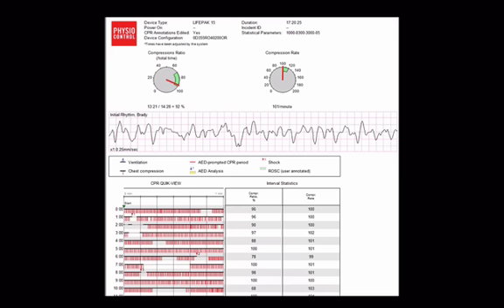Please let me know any questions or clarification, and please share these reports with those that you work with on resuscitations. The best way to use them is as a discussion tool, kind of a debriefing device to talk over the resuscitation afterwards, learn what we can do better the next time, and how we can improve both individually, as a team, and across the whole service.